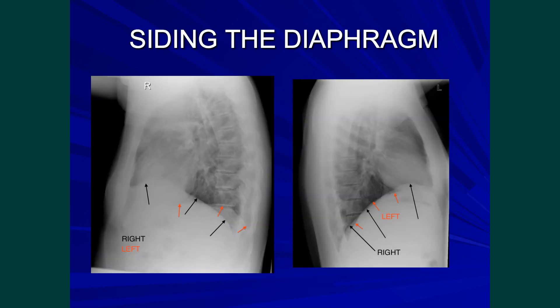Here is another example. The left hemidiaphragm is seen from back to front and stops as it reaches the cardiac silhouette. The right hemidiaphragm is seen from back to front and is uninterrupted even as it goes across the cardiac silhouette.